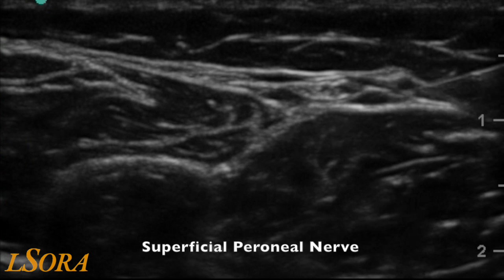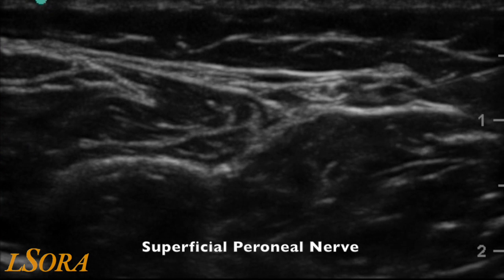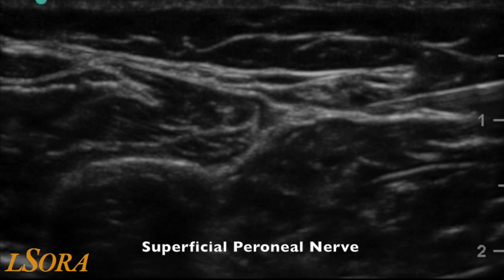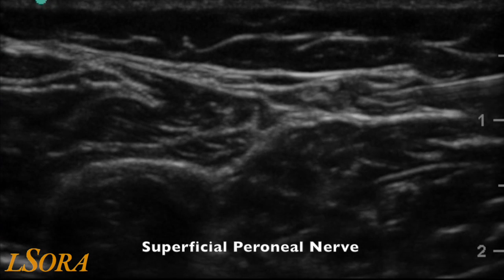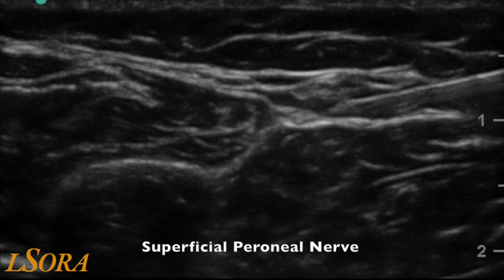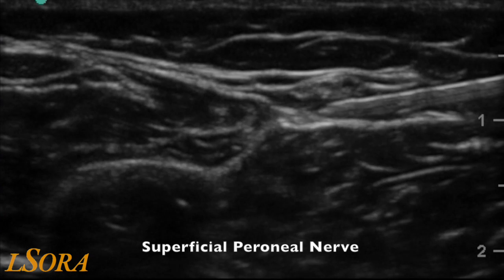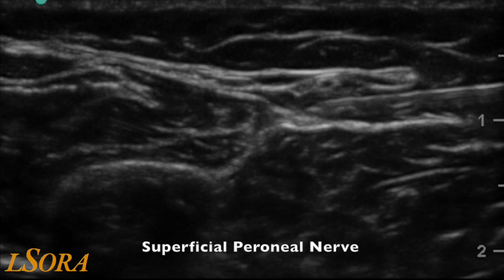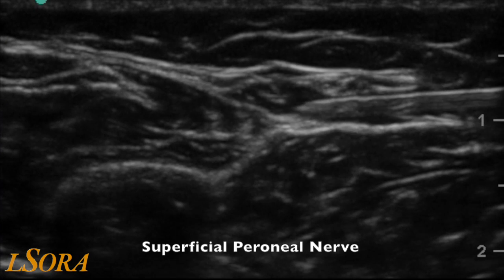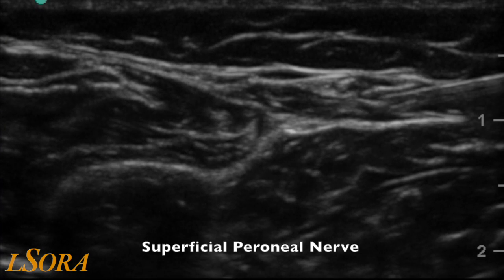In this block of the superficial peroneal nerve, you see the needle introduced in-plane from the right-hand side of the screen. Small aliquots of local anaesthetic are used to locate the nerve and surround it with local anaesthetic.